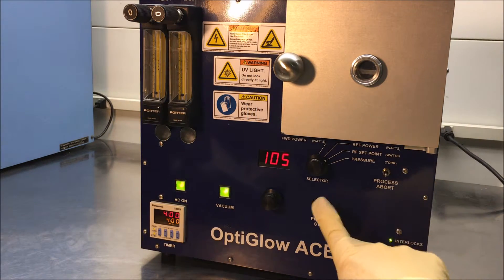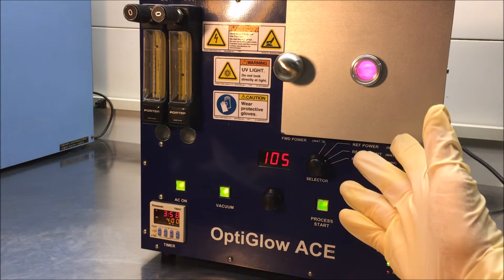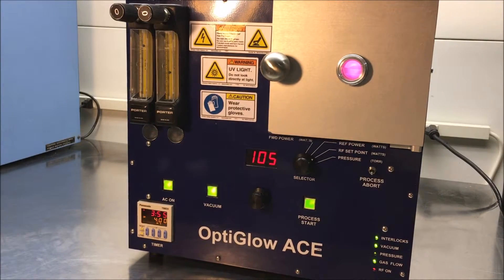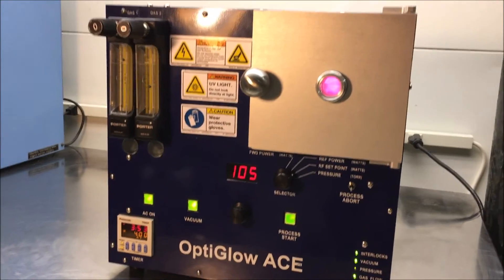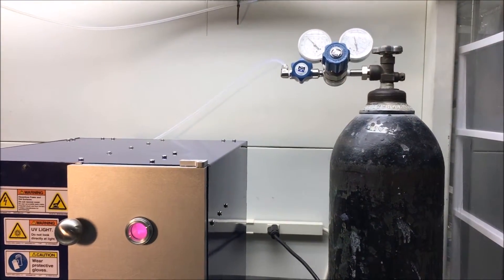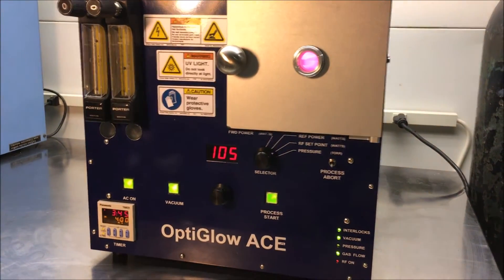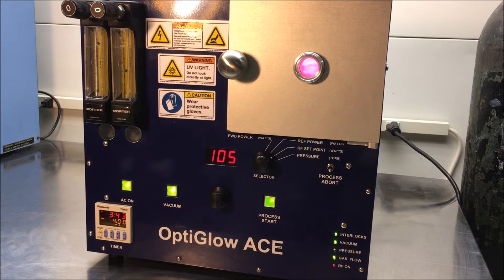Once again, we'll go ahead and start the process and you can see the plasma in the chamber itself. It is important to bring your gases in at about 10 PSI, so you should have your gases regulated to about 10 PSI. It comes into the back of the system and it's very easy to see how it hooks up.